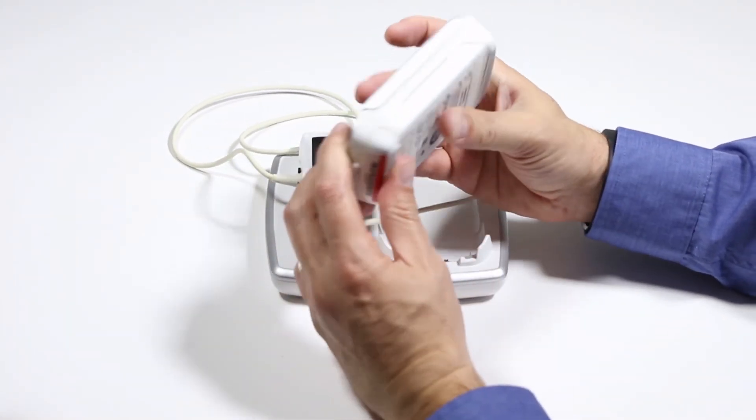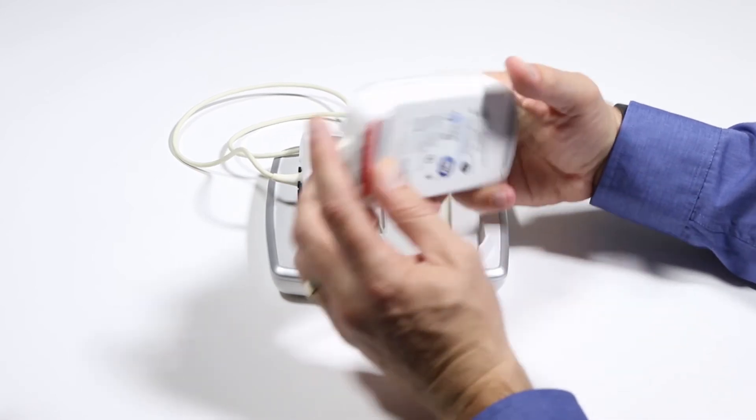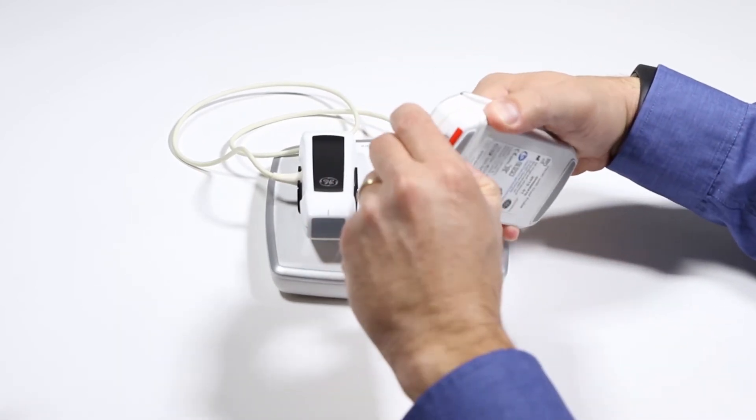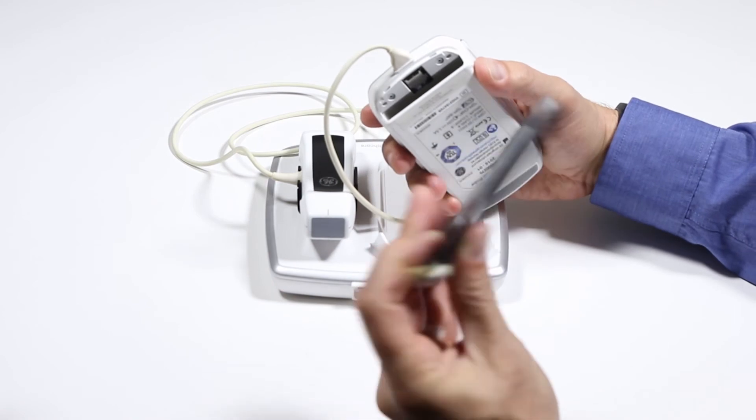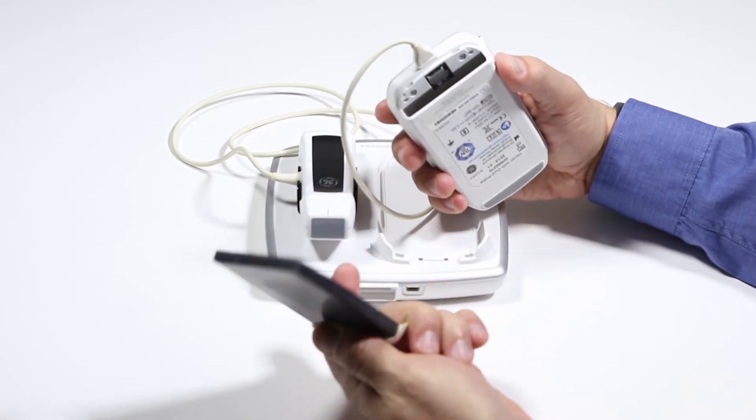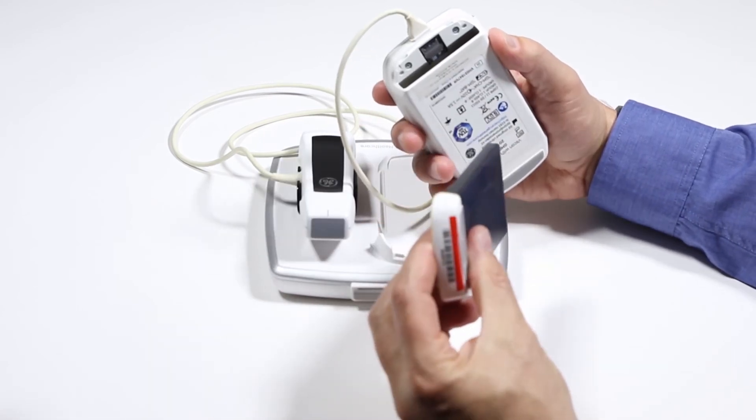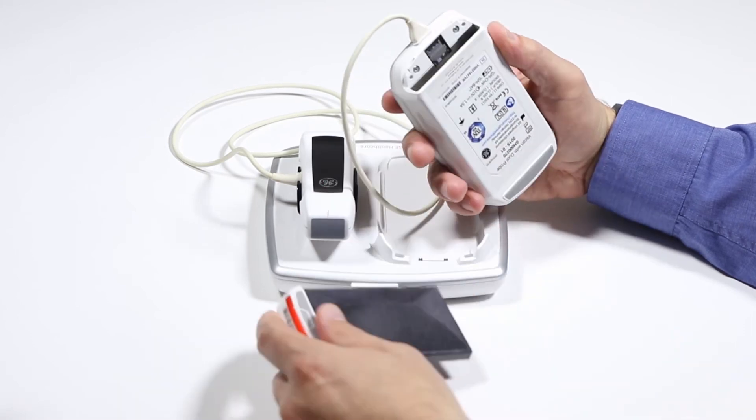Back here you have a compartment for your battery where you can just push down, slide out, and if you get an additional battery you can add that on and swap out batteries so you don't miss.